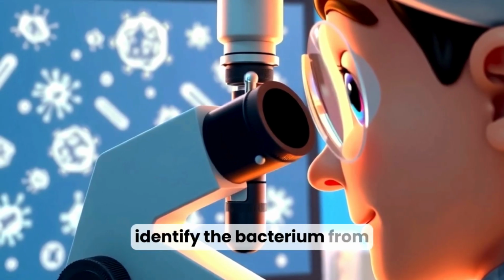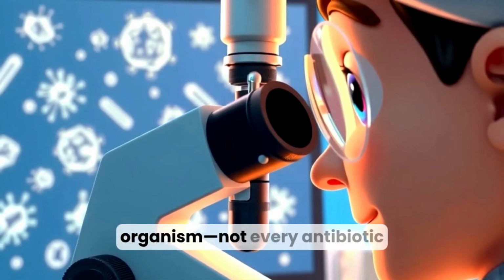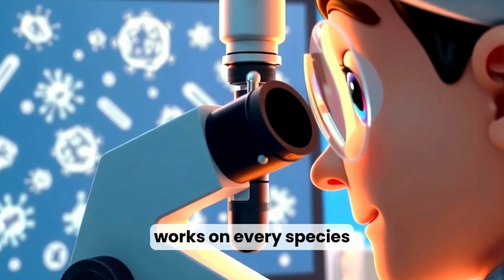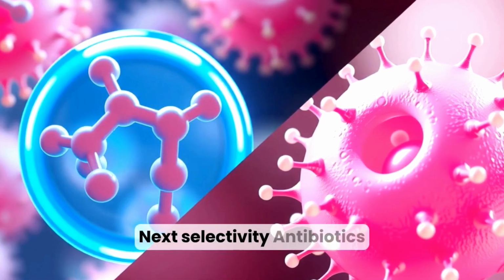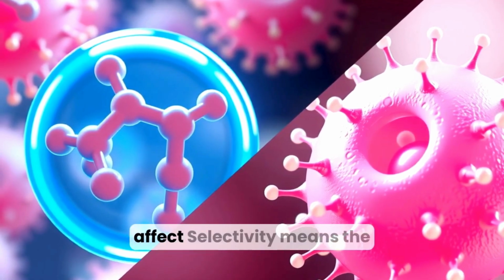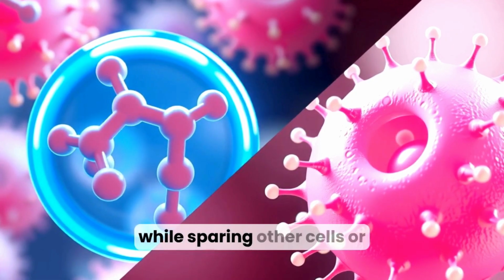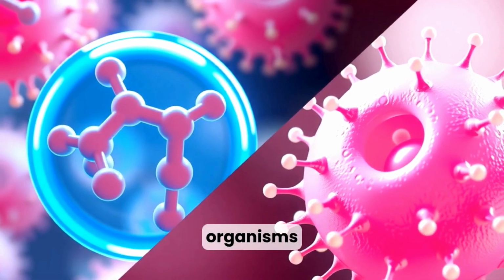Labs identify the bacterium from the patient sample, so testing targets the correct organism. Not every antibiotic works on every species. Next, selectivity. Antibiotics vary in which bacteria they affect. Selectivity means the drug targets the pathogen, while sparing other cells or organisms.